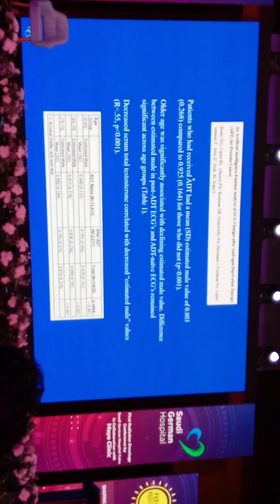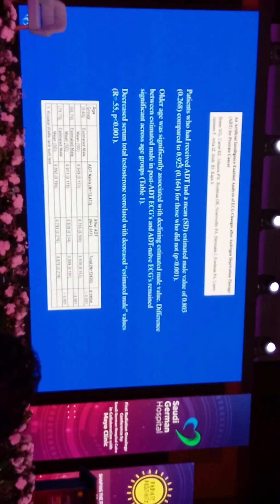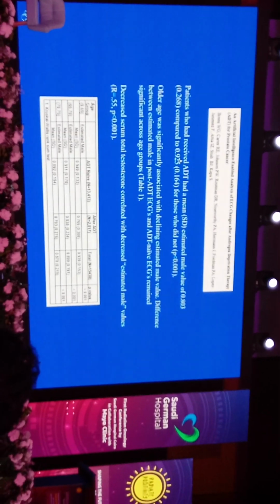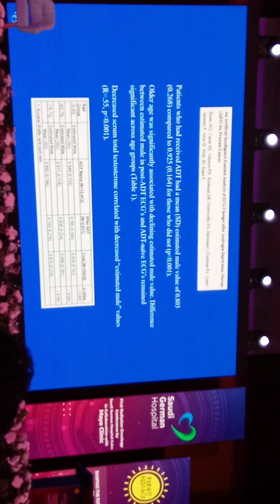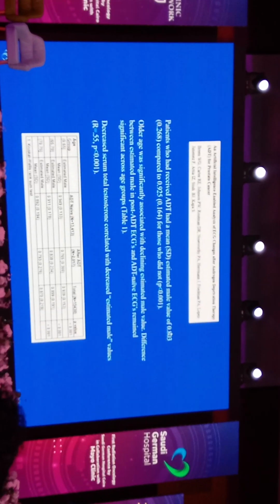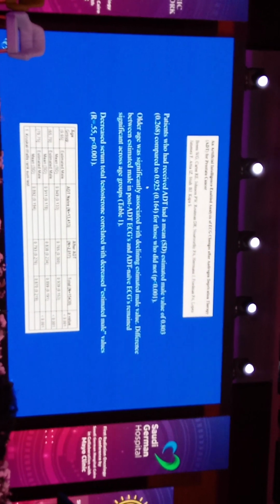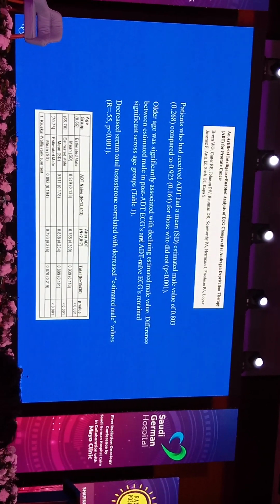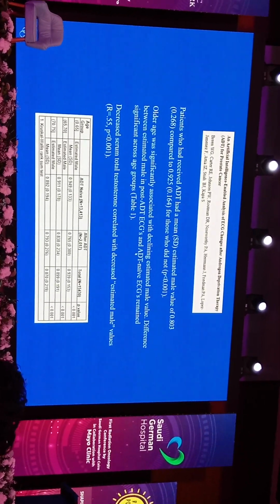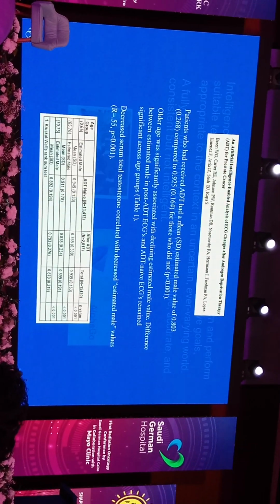And we see that if we apply this to men that were undergoing androgen deprivation therapy, there is a change in the way that the computer estimates them being male versus female. So men receiving ADT had a lower male value. Now exactly what that means in terms of outcomes we don't know, but it shows that the ECG is picking up on hormonal changes that are present based on the receipt of ADT. And so this is a novel variable that can be applied to other data sets.